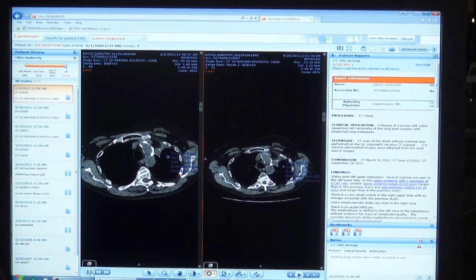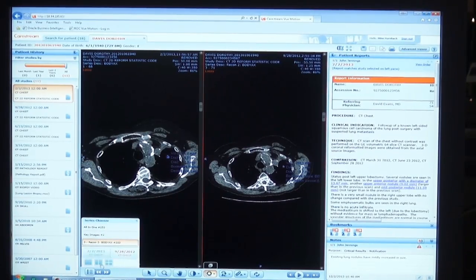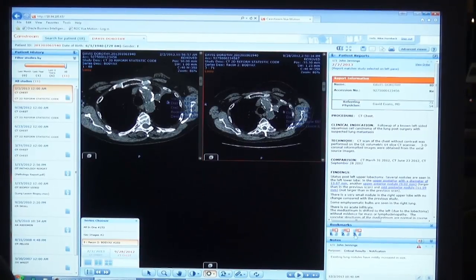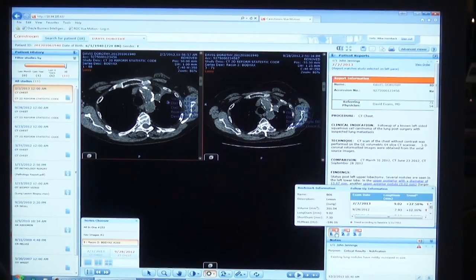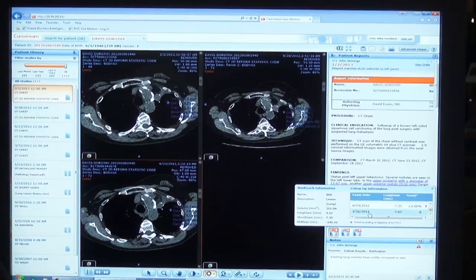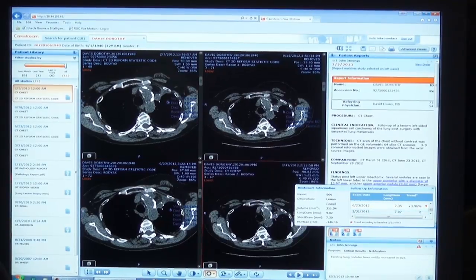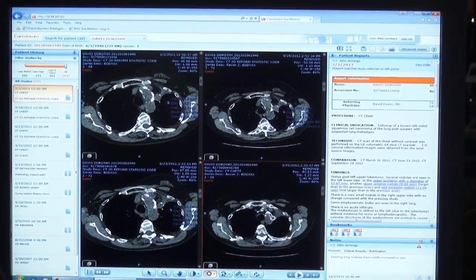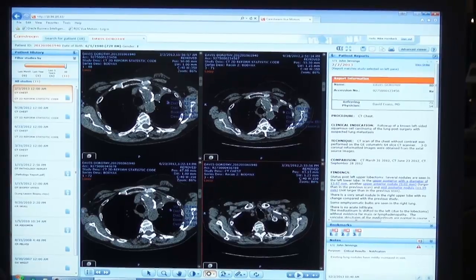Furthermore, we've added additional displays for a two-by-two display. So I can actually come into my bookmarks and look at additional priors, side-by-side with annotations automatically displayed.